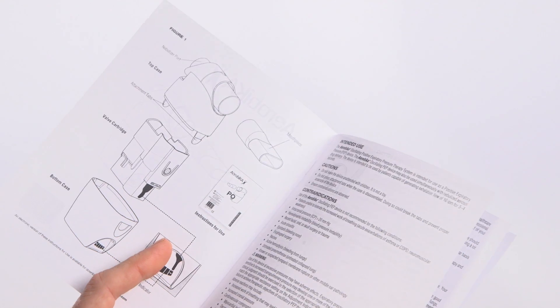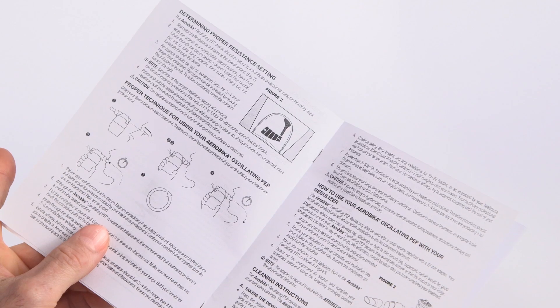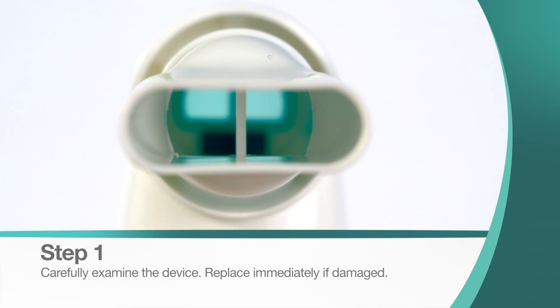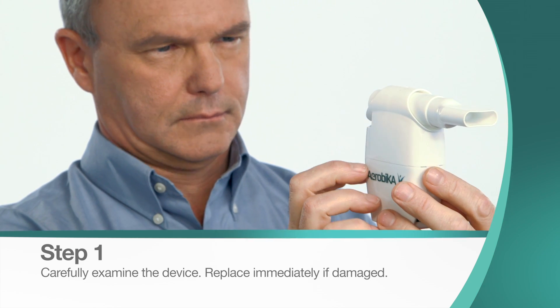The Aerobica Oscillating PEP device can be used right out of the package. Before use, ensure you have read the instructions for use included with your device. First, look at the device and make sure it is not damaged. If it is damaged, replace it immediately.